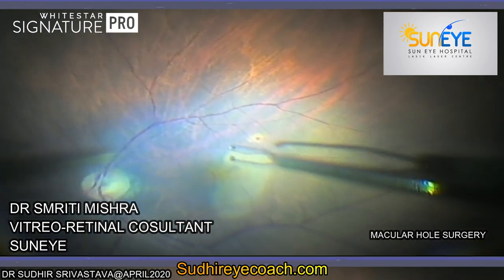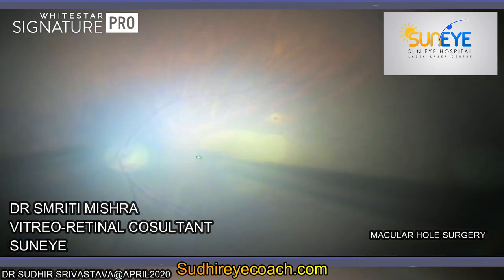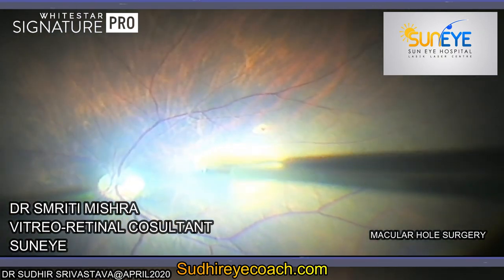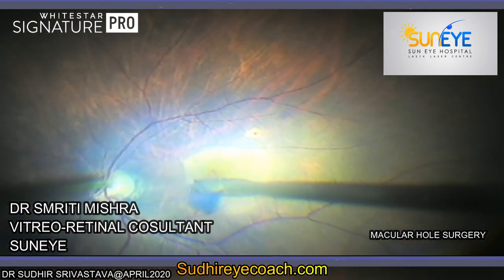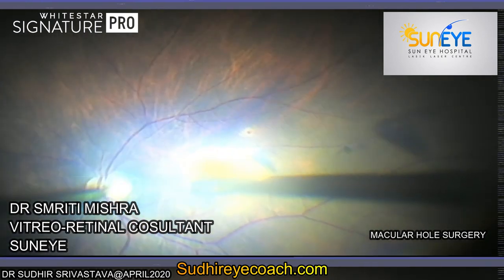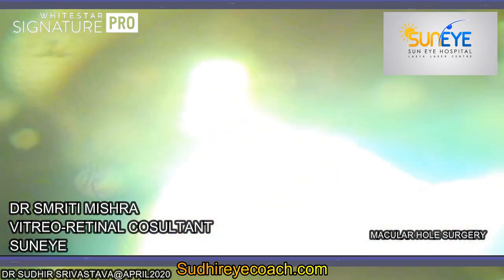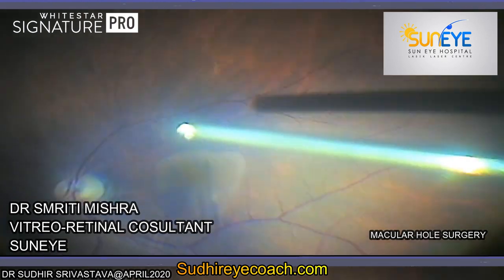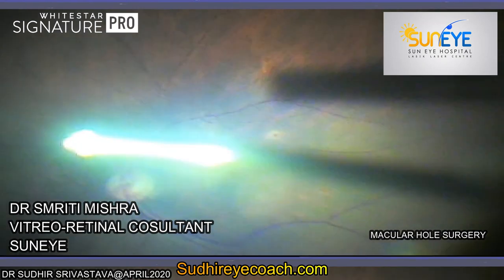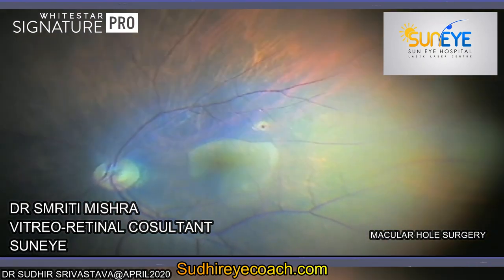After fluid-air exchange, the ILM was nicked with an ILM peeling forcep. Then, carefully under proper visualisation, the torn edge of ILM was held and the rexis was initiated. For initiating a good controlled anterior capsular rexis, proper anterior chamber tamponade with viscoelastic is a must. Any bulge or thrust on the anterior capsule can create problems, causing an extension of the capsular rexis toward the periphery.